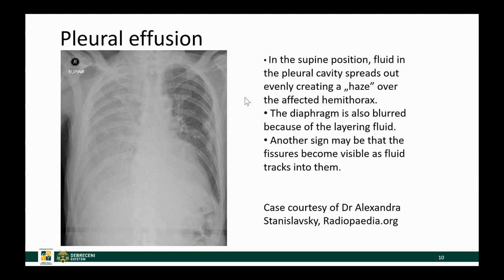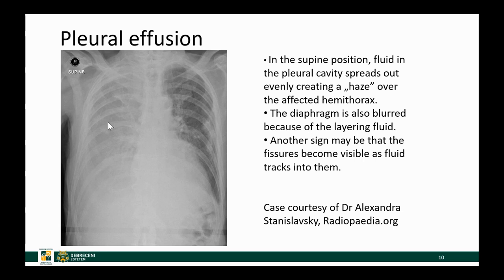Now we're back with the supine film, which as a radiologist I do not like, because a lot of disease goes undetected on the supine film unless the abnormality is striking. This patient has a lot of fluid in the right pleural cavity. You can tell by noting that the contour of the right hemidiaphragm is lost, and there is a diffuse, quite homogeneous opacity over the right lung. The fluid within the pleural space takes up the available space, so you will see added haziness over the whole lung, and sometimes you will see fluid within the fissures as well.